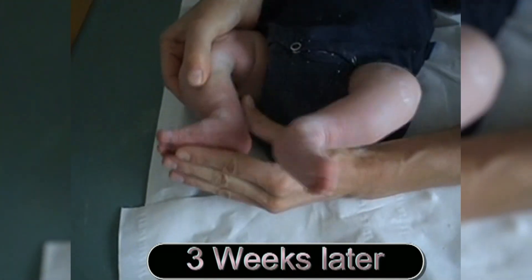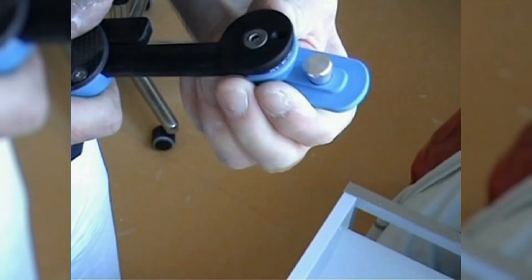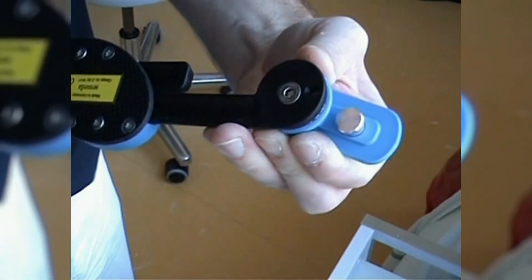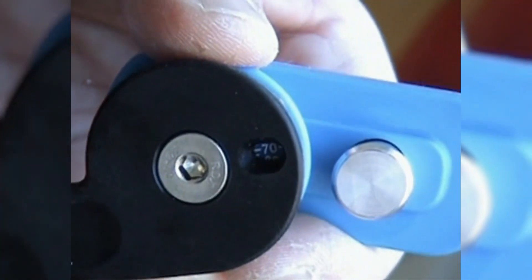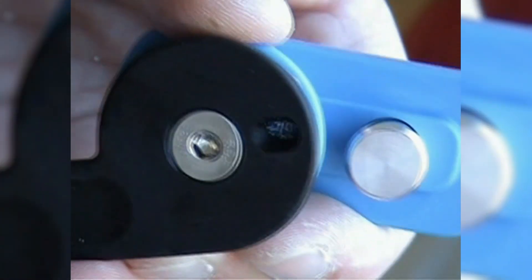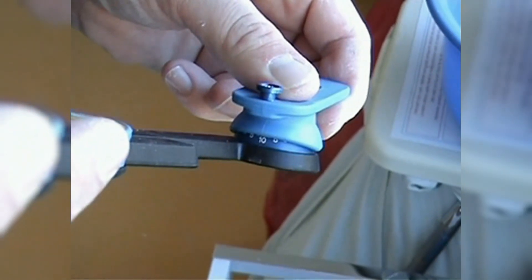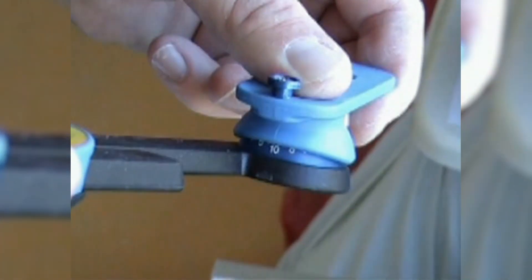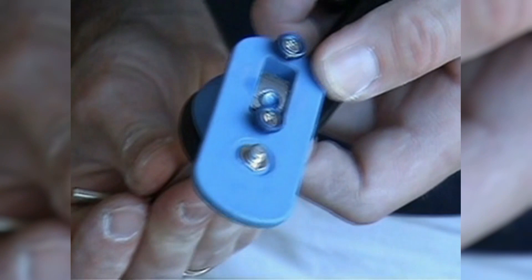Three weeks later you will witness a very satisfying dorsal extension in both feet. The foot abduction brace is applied immediately. The viewing window on the underside aids in adjusting the abduction angle. The affected foot is usually fixed at 70 degrees of abduction, while the healthy foot is fixed at 40 degrees. The dorsal extension can be adjusted as well. To avoid any loosening, we recommend using Loctite during the first adjustment by the orthopaedic technician.